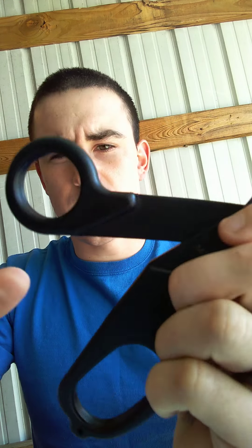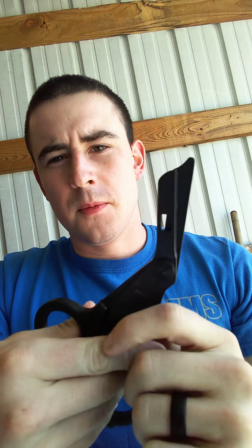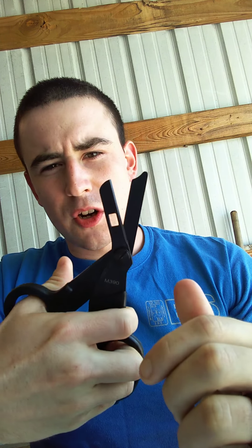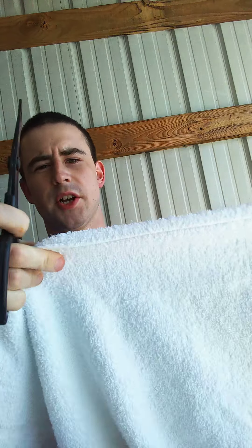So those are the positives. Overall, it's not a terrible product. Would I buy it again? No, absolutely not. If you're in a hospital setting, or if you're just trying to cut bandages or cut something straight, it works very well and it's got a sharp blade for that.